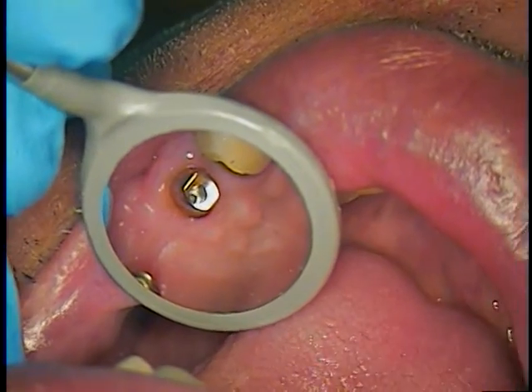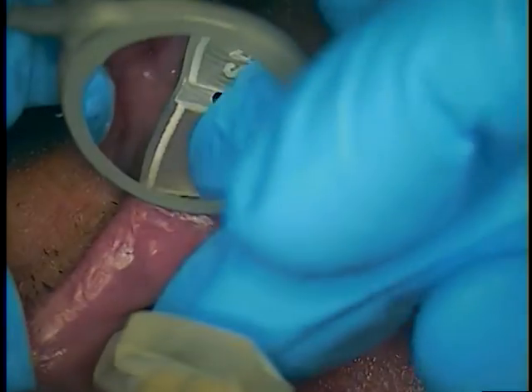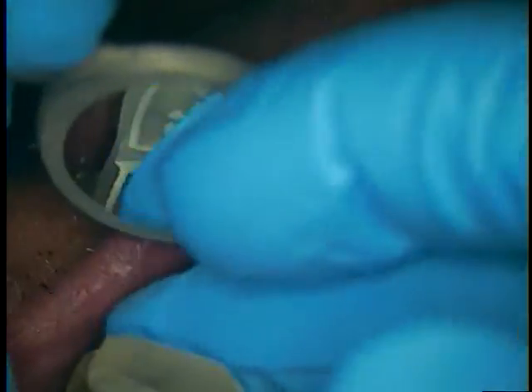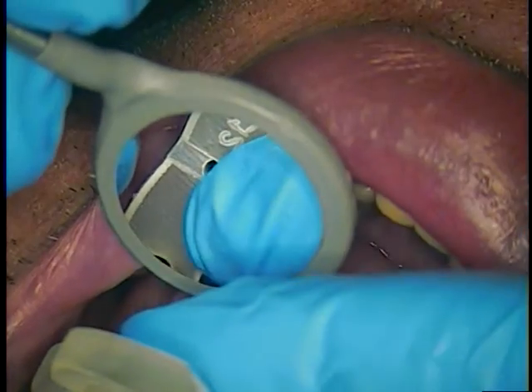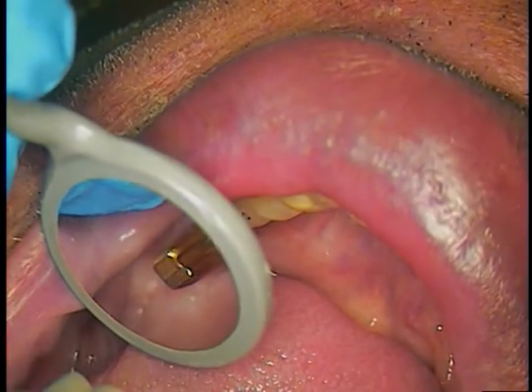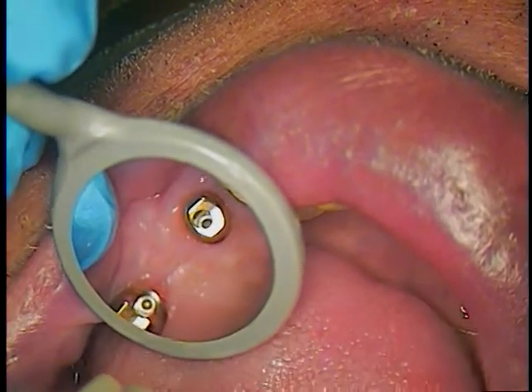These were actually aligned perfectly using the try-in jig from the same company, Dent Supply Atlantis. When we push that all in place, you can see how that all bottoms out nicely and it also touches his anteriors without any rocking. You order that from the lab — that's a try-in jig. They print that along with the abutments, which are milled individually from CAD-CAM, and then they're serrated on the surface and gold plated.